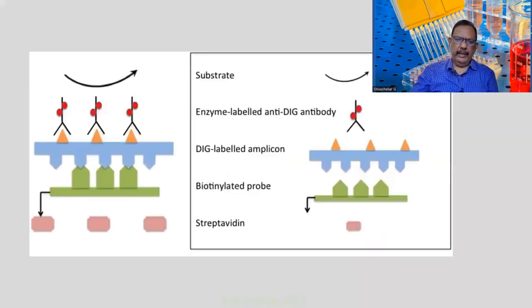See, this is what is happening. So streptavidin is supposed to be a binding material. Then there is a probe, and you find that there can be a labeled conjugate. Finally, there is an antibody and there is a substrate or a coloring substance. So this is how it happens. You find that the wells are being coated with the specific substance, then the antibody to the substrate, which can be identified and measured. As I mentioned earlier, it can be for a single sample, single antigen, or it can be for multiple.